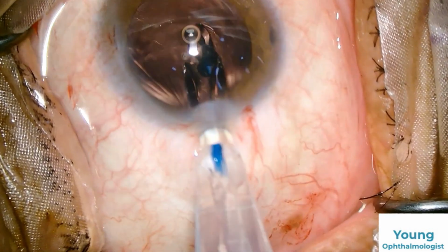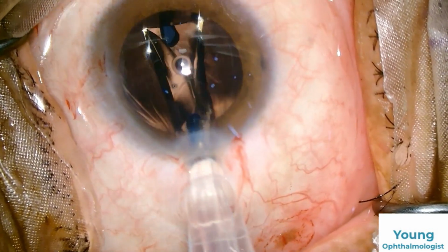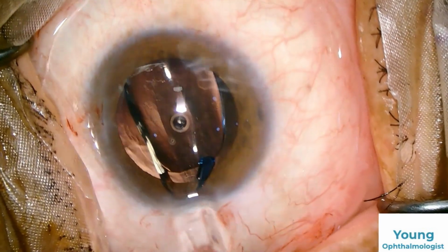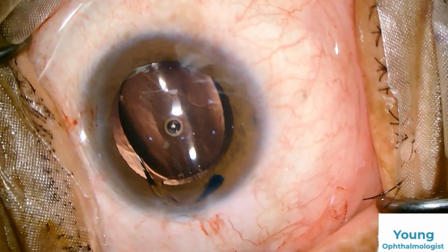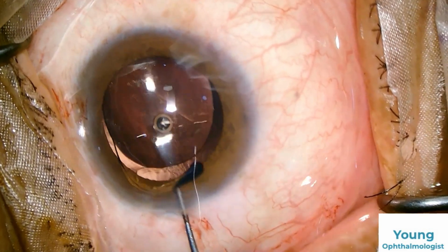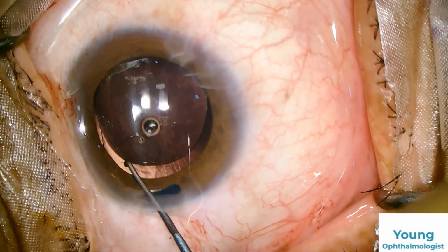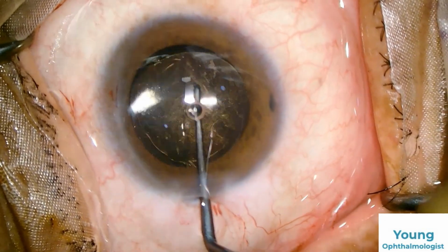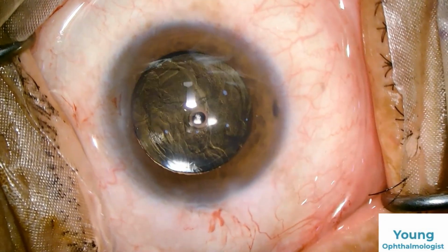It's a Hoya 250 preloaded lens with multi-cert injector. In these diabetic patients, it's always advisable to use hydrophobic lenses. Avoid using hydrophilic lenses. These days, we are not using hydrophilic lenses in any case because there are high chances of PCO.